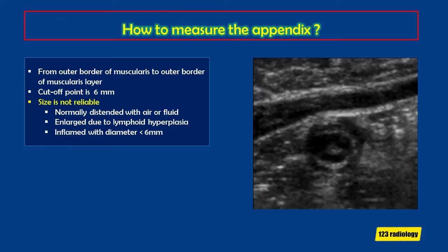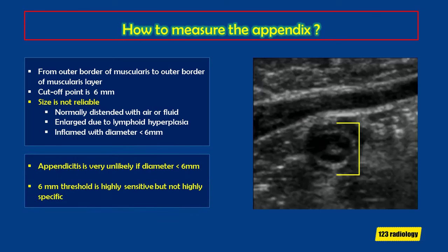Always measure the appendix from the outer border of the muscularis layer to the other side. The literature cut-off point is 6 mm, but this is not fully reliable — the appendix may be normally distended with air or fluid with no secondary signs of inflammation and the patient is asymptomatic. In children, the appendix can be large due to lymphoid hyperplasia. The appendix may be less than 6 mm but surrounding tissues show secondary signs of appendicitis. The 6 mm threshold is highly sensitive but not highly specific.